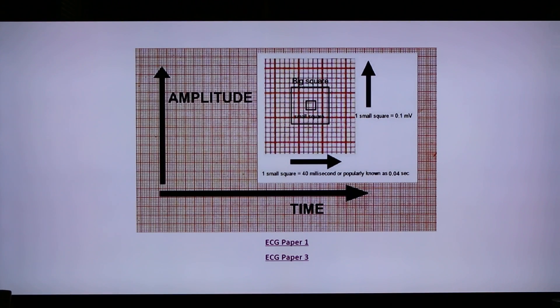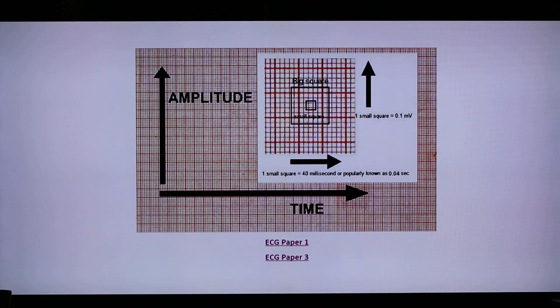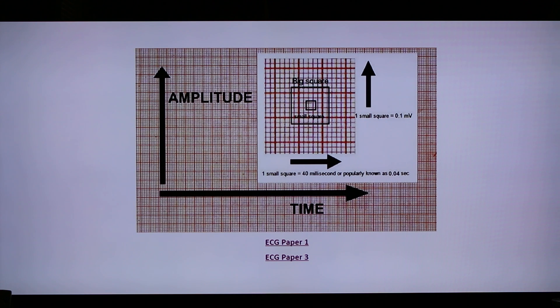For time reference, the small box is equivalent to 40 milliseconds or 0.04 seconds. Five small boxes comprise one big box, which is equivalent to 200 milliseconds or 0.2 seconds.